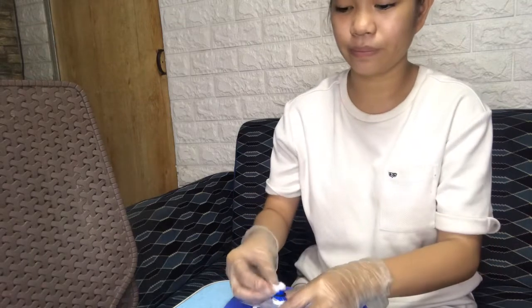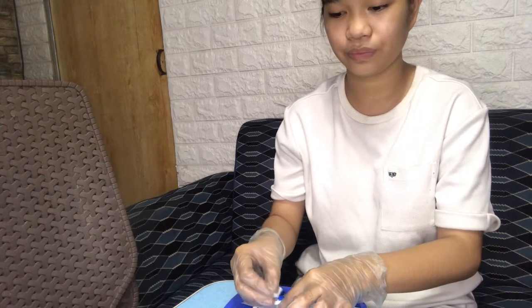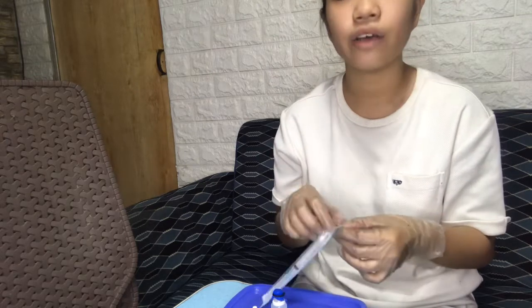So after we rotate this vial, let's remove the cap and clean the rubber cap of a previously opened vial with an antiseptic solution or antiseptic wipe. Let's clean this in a circular motion. Next, let's withdraw the medication.